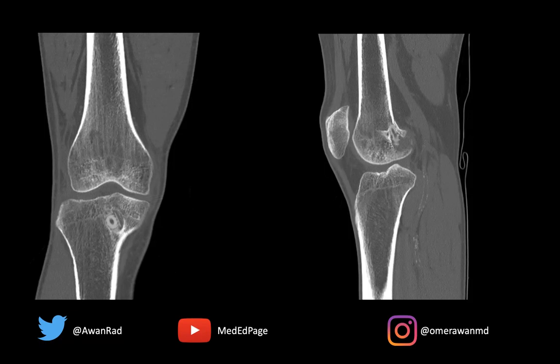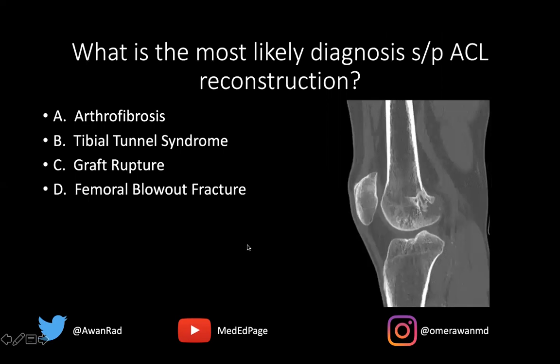We have coronal and sagittal CT images through the knee, and notice that this patient has had an ACL reconstruction. We can see the tunnel of the ACL graft here. So this patient has an ACL reconstruction, and the question is: what is the most likely diagnosis status post-ACL reconstruction?